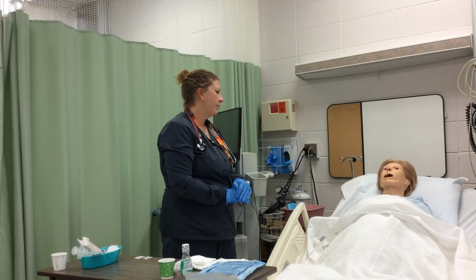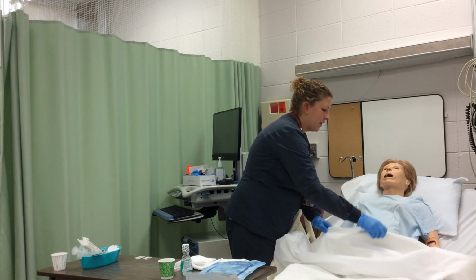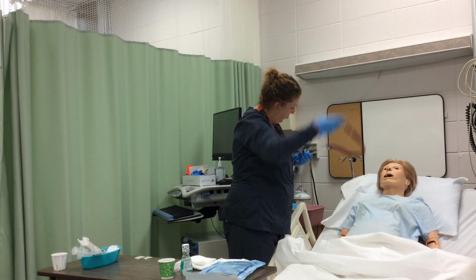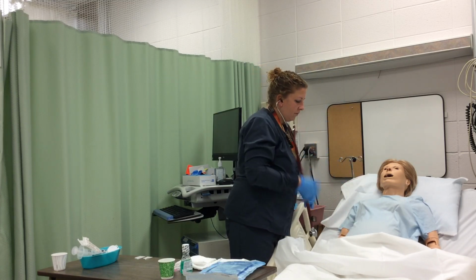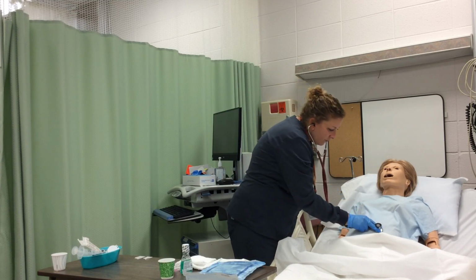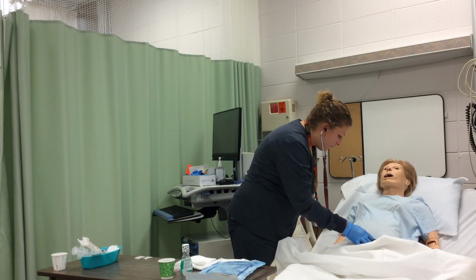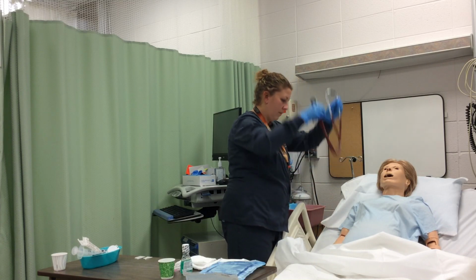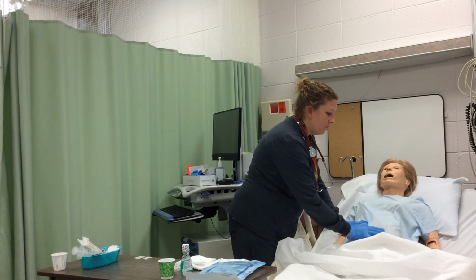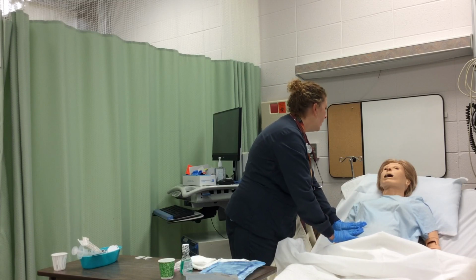Perform abdominal assessment, including listening to abdominal sounds. I'm just going to listen to your abdomen with my stethoscope. All sounds are active times 4. Abdomen is firm and round. Is your belly painful at all? And tender.